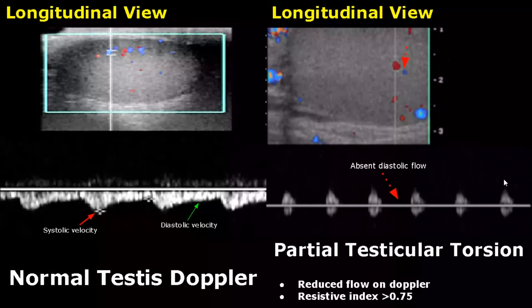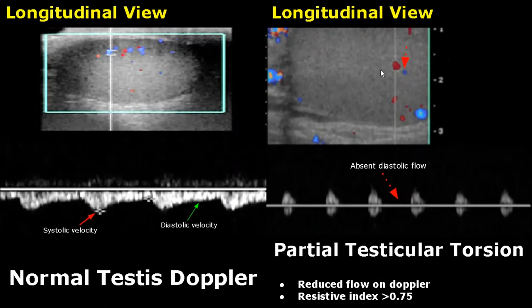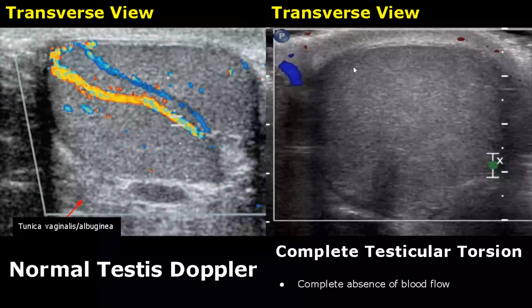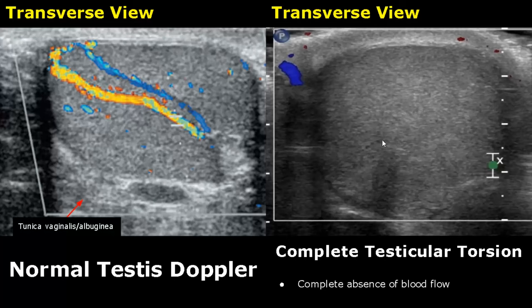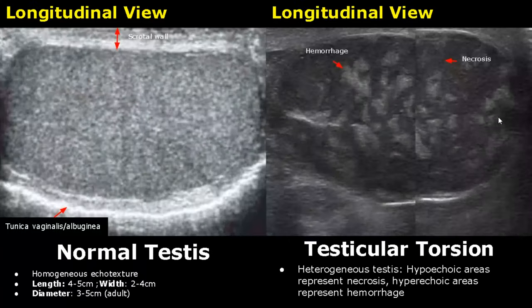In partial testicular torsion there will be reduced blood flow within the testis, examined with spectral Doppler. The normal spectral waveform shows normal systolic and diastolic flow, whereas in partial torsion there is absent diastolic flow and the resistive index will be greater than 0.75. In complete testicular torsion, color Doppler shows complete absence of blood flow within the testis. A late finding of testicular torsion shows the testis appearing heterogeneous — the hypoechoic areas represent necrosis and the hyperechoic areas represent hemorrhage.